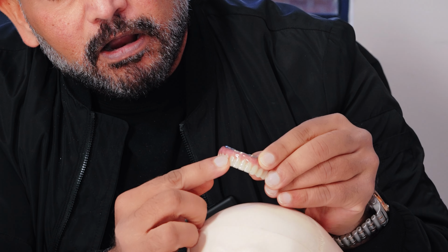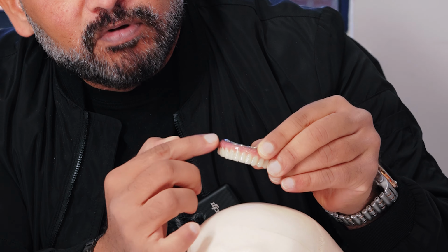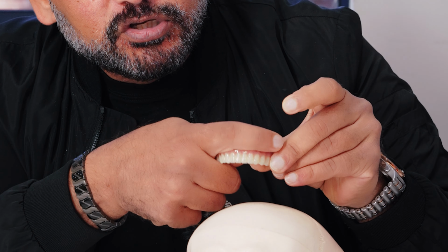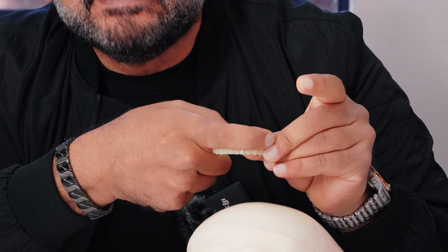The prosthesis, as you can see, is designed not just to replace the tooth part, but is also designed to replace the lost gum, so we have an even gum line, and to support the lip behind it.